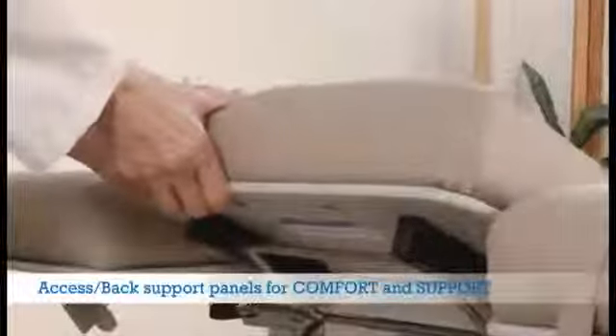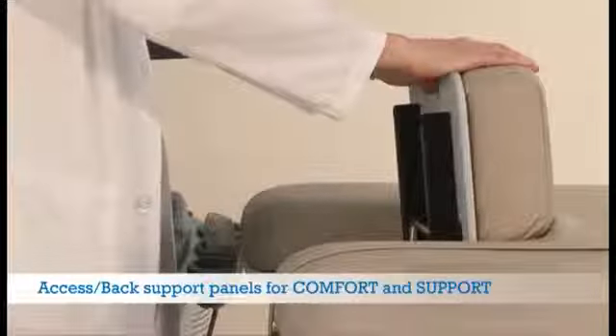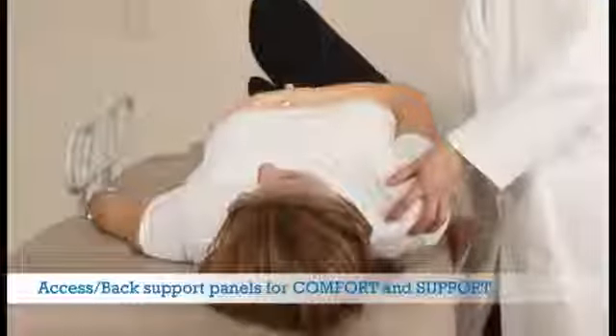Adjustable access back support panels are available on both sides and offer four different angles of support. The access area features no sharp surfaces to ensure your safety. The easy-to-use design is comfortable for both the patient and the sonographer.